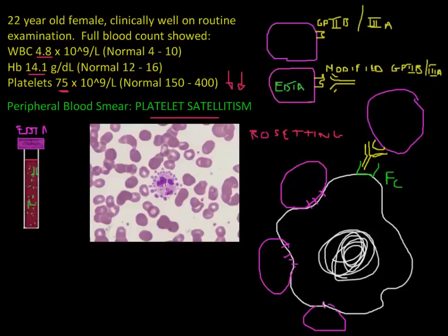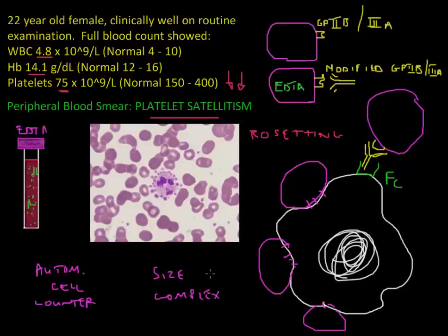When you put this tube of blood through an automated cell counter, the counter measures cells as they come through, looking at cell size and complexity — as explained before in the talk on platelet clumping, which is a slightly different phenomenon. The platelets will now be counted as part of the white blood cells and will not be counted individually. Therefore the platelet count will be falsely low — note: falsely decreased.